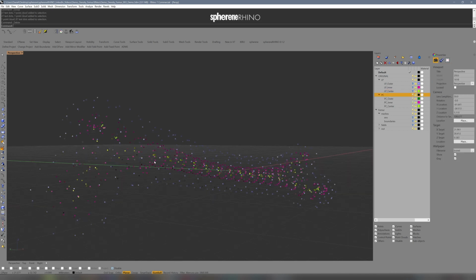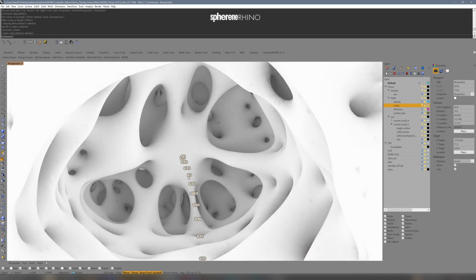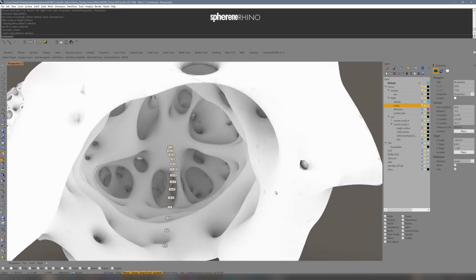When I finished with all my density points and grouping them together and giving them values, I deleted the ones I didn't need. Looking at the result, we can see the channel that has been created by the use of cavity points. A cavity point creates a spherical empty space, pushing the ADMS to the side so that we were able to create this channel.